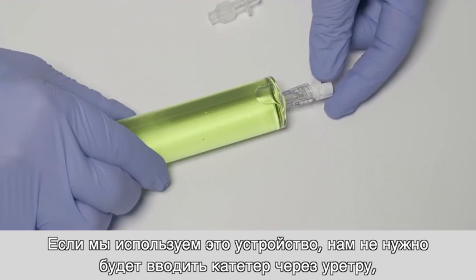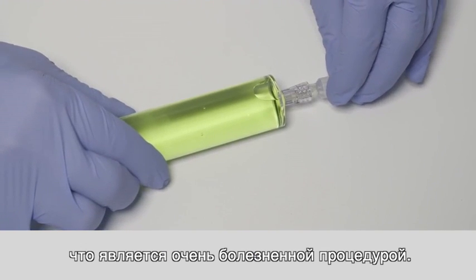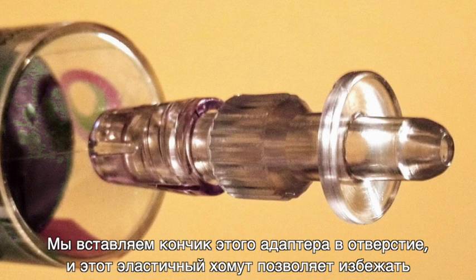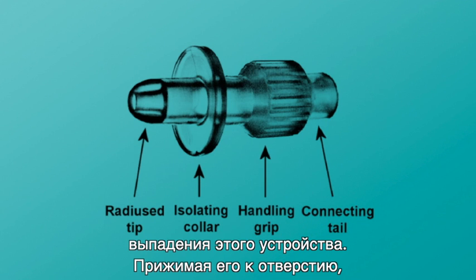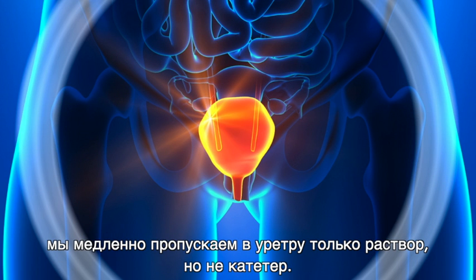If we use this, we don't need to put a catheter through the urethra, which is a very painful procedure. Instead, we put the tip of this adapter into the orifice, and this elastic collar makes the procedure drop-free. By pressing it against the orifice, we slowly let flow only the solution into the urethra and not a catheter.